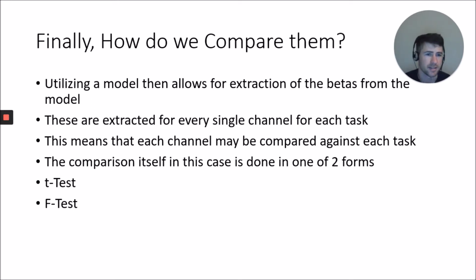Usually that's going to be, in the case of finger tapping, a t-test. It's because you have 2 conditions, straightforward, you compare them against each other. If you have more than 2 conditions, you would likely use an f-test.